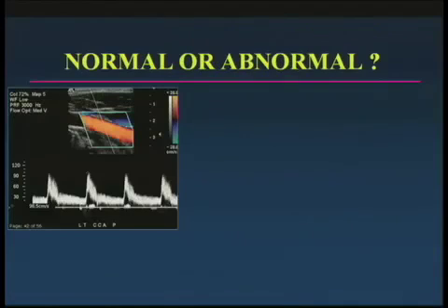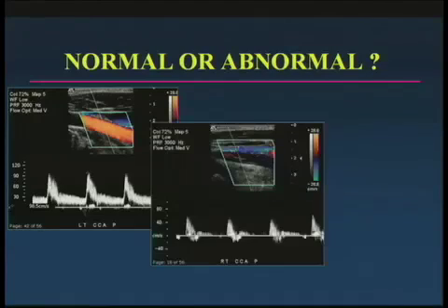Well, what about this case? And this will help you avoid making a mistake, I think, if you pay attention to these waveforms. Is this normal or abnormal? This is the left side, and I will tell you that this is a normal waveform. And here's the right common in comparison. And there's no diastolic flow.